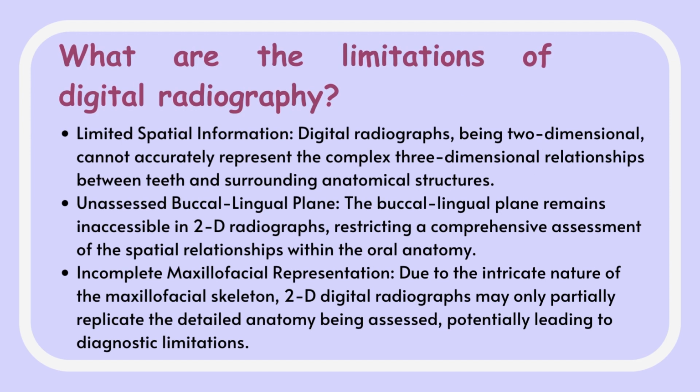What are the limitations of digital radiography? Limited spatial information. Digital radiography, being two-dimensional, cannot accurately represent the three-dimensional relationship between teeth and surrounding anatomical structures. Unassessed buccal lingual plane. The buccal lingual plane remains inaccessible in 2D radiographs, restricting a comprehensive assessment of the spatial relationship between the oral anatomy.